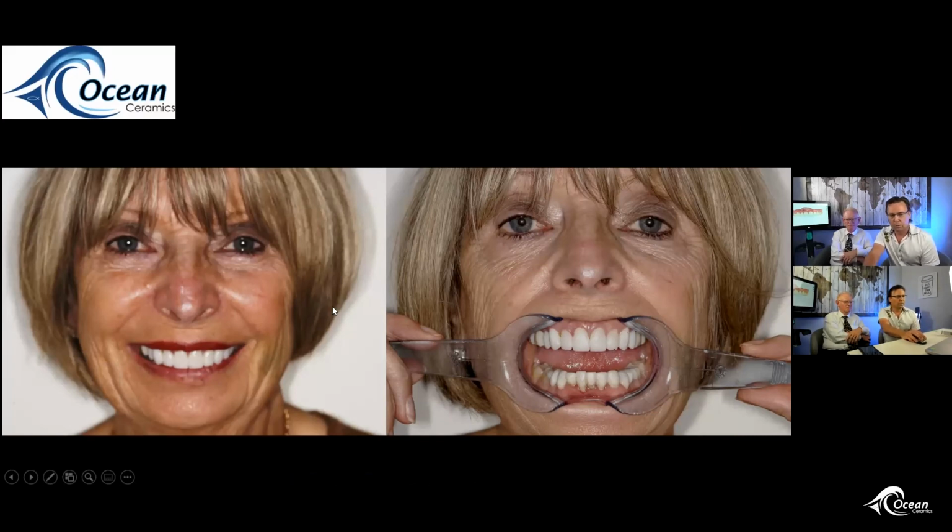Anyhow, this is part of our SMILE protocol in action. So we milled the temps here in bleach white. We treatment planned the full arch. And I was actually on a FaceTime with Maggie here in the operatory. I said, Maggie, let me see your teeth on FaceTime.